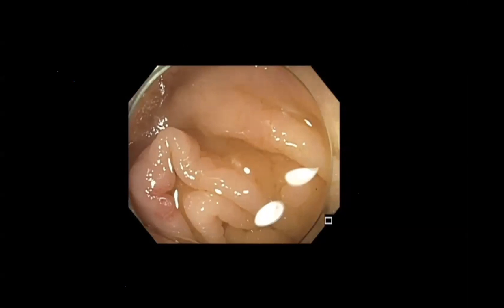The reason I want to share that is, whenever you see angioectasia, they are always relatively flat. But when there is a soft tissue mass underneath it, you need to think that there's a bigger vessel feeding. And if you go and do APC straight, you may end up with a bigger vessel bleed, and then you will be firing a lot. And as you fire a lot of APC, you are going to burn deep. And as you burn deep, you're going to create a perforation.